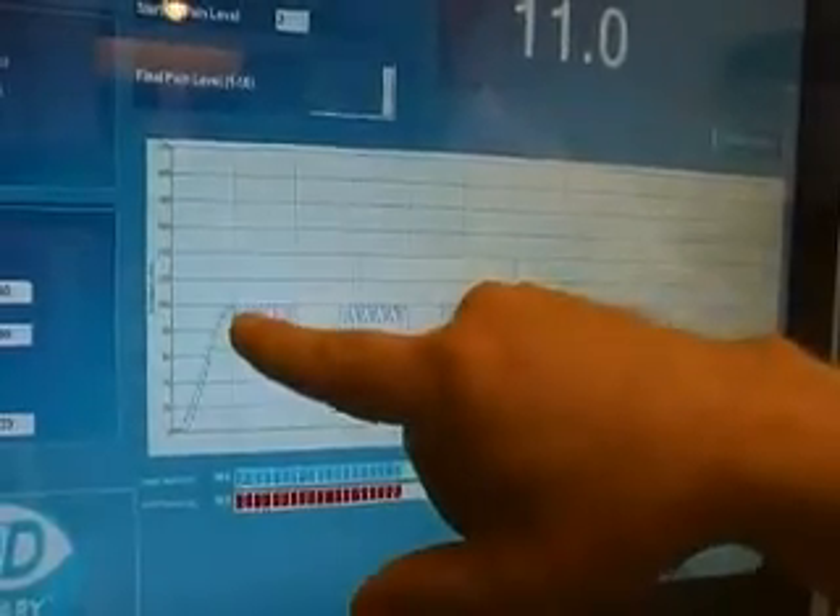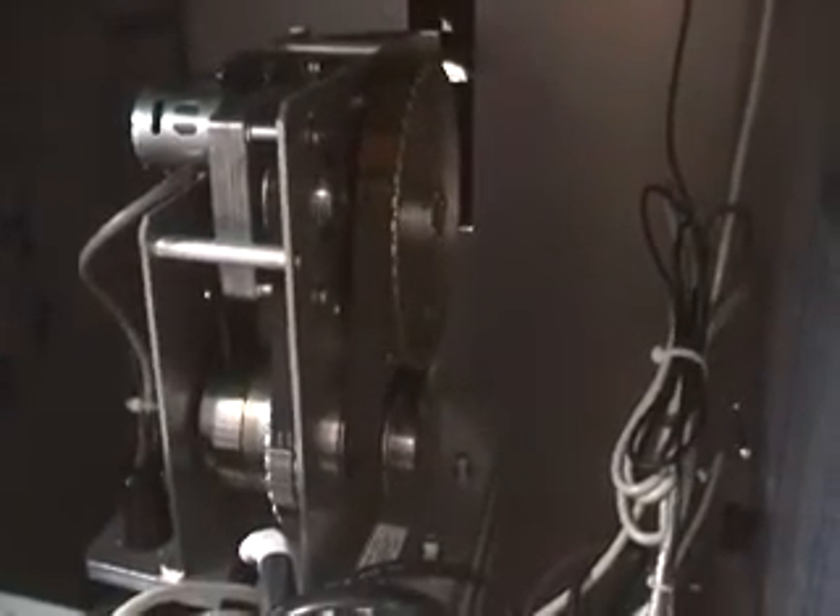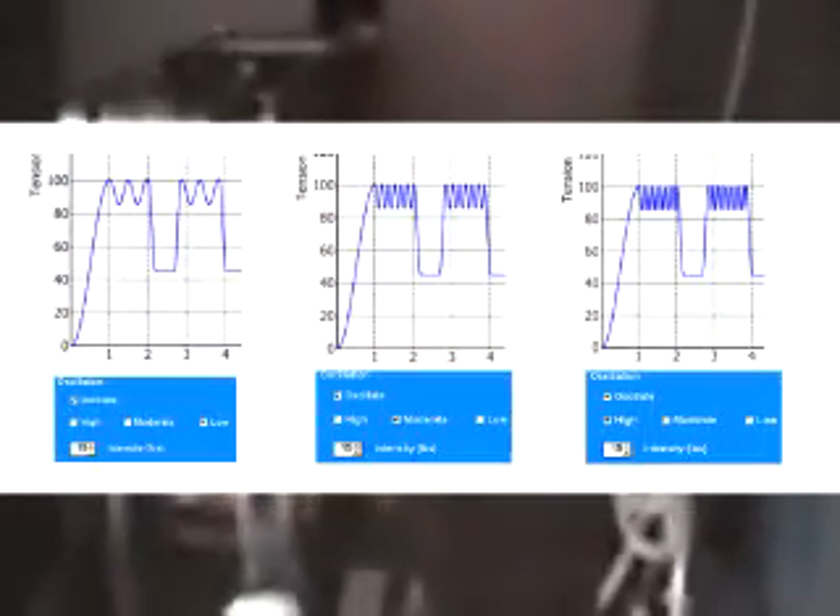We're now going into the oscillation, which is the mobilization at the point of maximum distraction. Within the actual mechanics, you can see that it's gradually releasing and bringing the tension back on. That's hopefully working the soft tissues and creating small pressure differentials. We can adjust the degree of oscillation — the frequency, the number of cycles per minute, and the amount of tension as a function of the high hold.